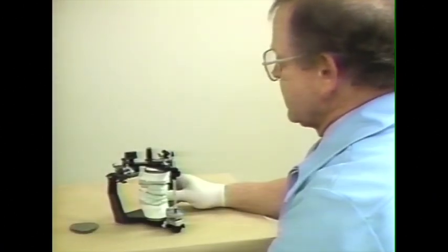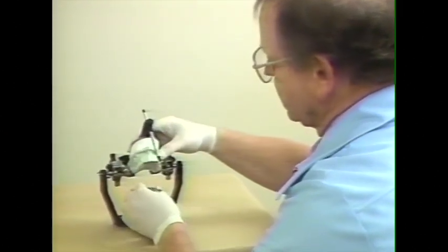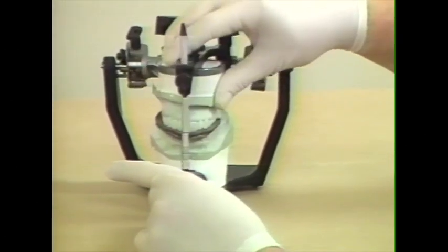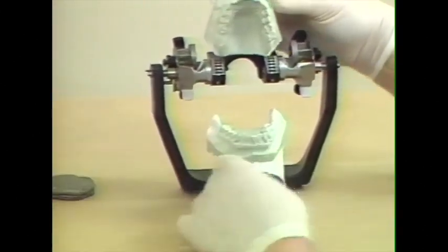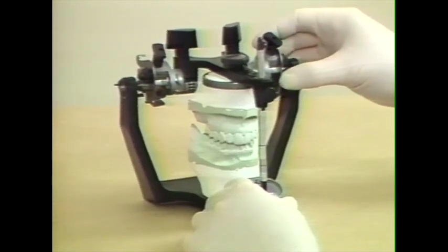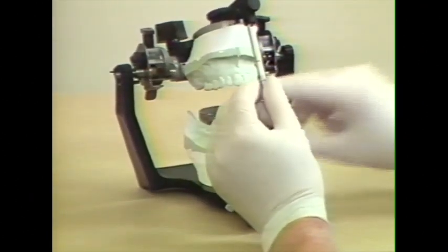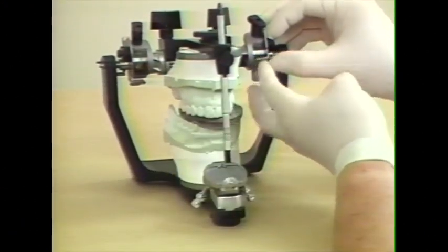We've now mounted the maxillary and mandibular casts. To mount the mandibular cast, we've used this centric relation record, and see it closes very nicely into this centric relation record. Now, to set the articulator according to the condylar registrations and the Bennett angle, we use the lateral check bites. And here we have the right lateral check bite. Place it into position. We have to unlock the centric locks.